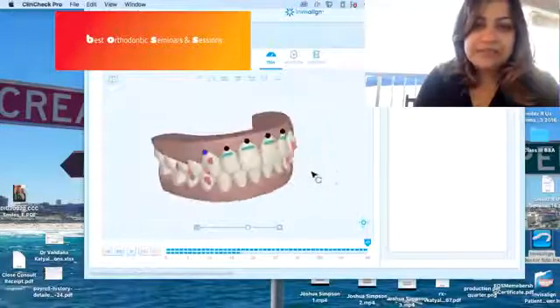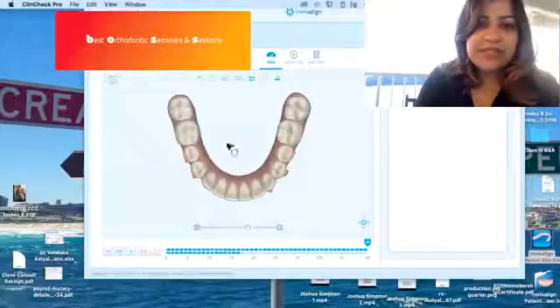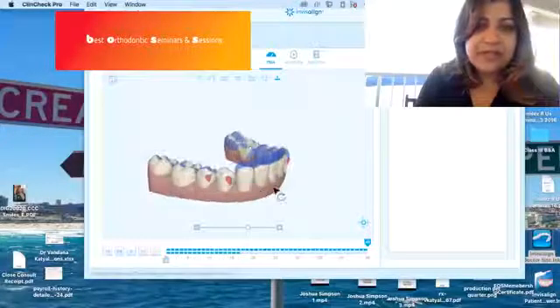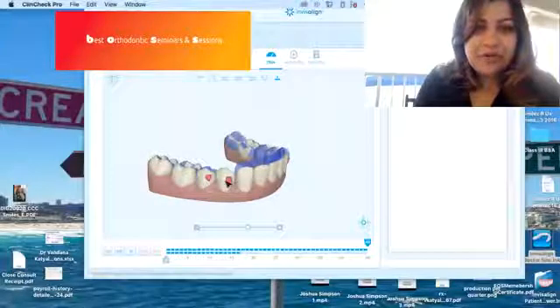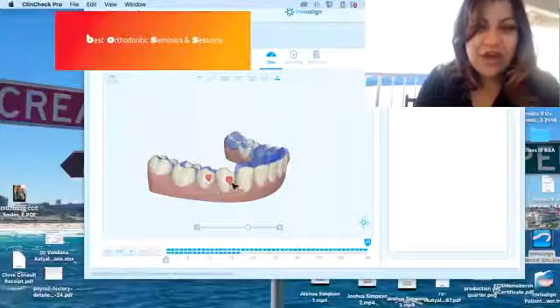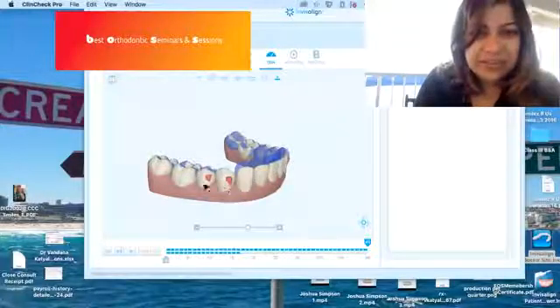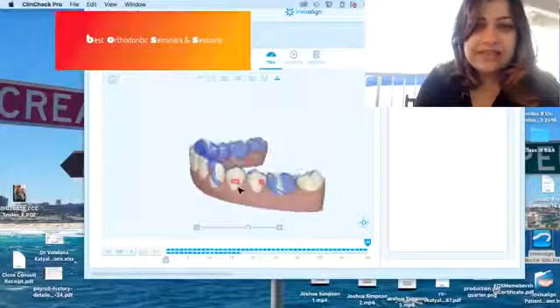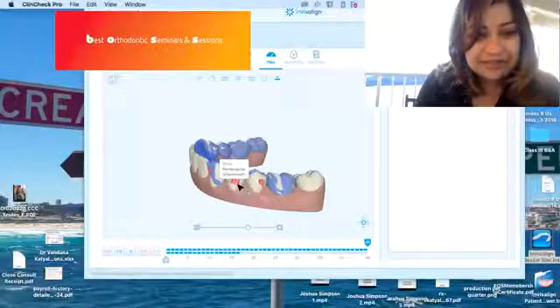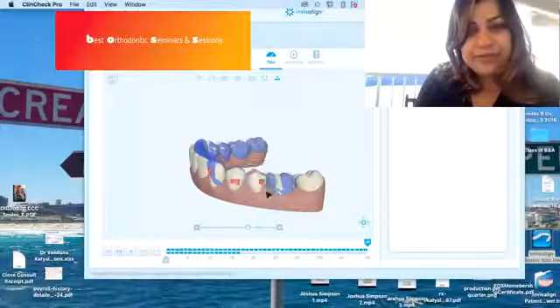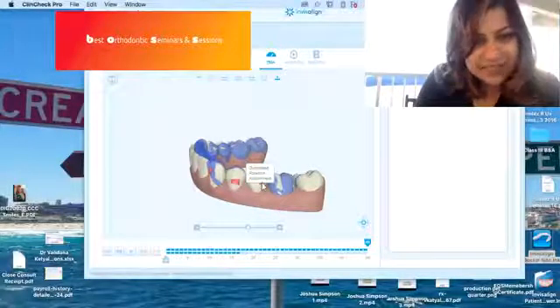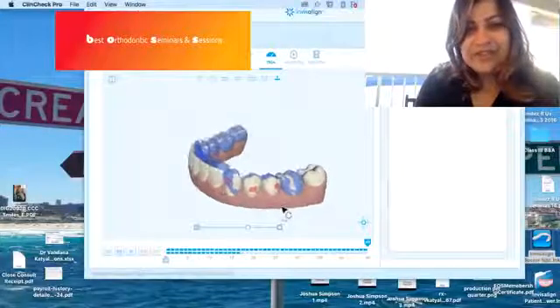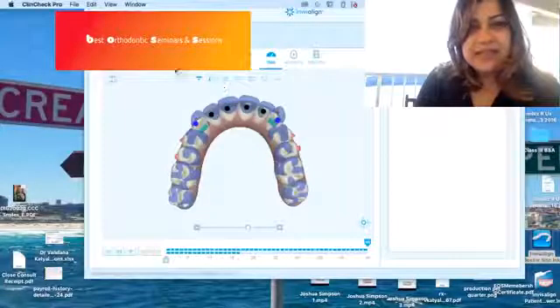Also, with the deep bite, you can see there was no extrusion done of the lower posteriors. And literally no attachments in the lower posteriors as well. These attachments on 4, 4 and 4, 5, they're not extrusion attachments, actually. They're optimized attachments for rotation. And what these premolars really need is extrusion. It's a brachyfacial case. This 3, 4, that's a good attachment. That will extrude that tooth. However, it's intruding. 3, 5 has actually got, again, an optimized rotation attachment. And, again, it's not extruding. So it's a completely wrong design plan.